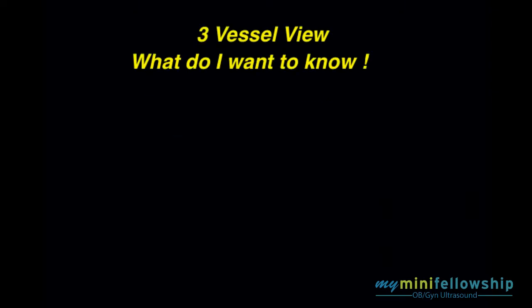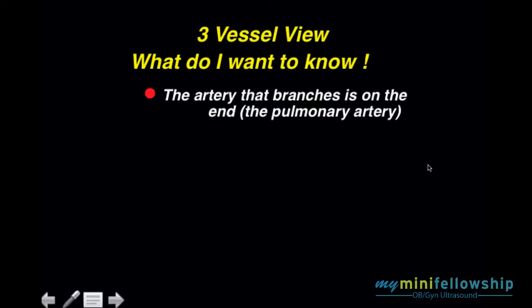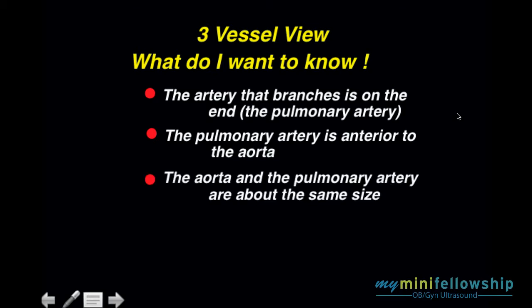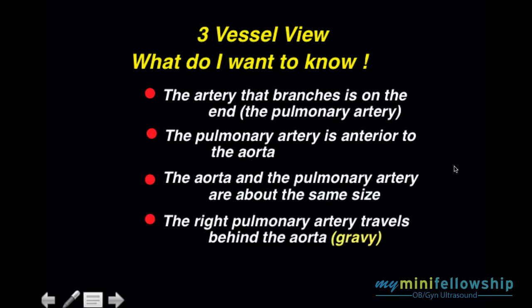What do I want to know about the three-vessel view? I want to see that the artery that branches is on the end — that's the pulmonary artery. I want the pulmonary artery to sit in a more anterior position than the aorta. I want the aorta and pulmonary artery to be about the same size — I'll modify that criterion a little later. Finally, the right pulmonary artery travels behind and touches the aorta, but I don't need to see that specifically; any branch confirms the pulmonary artery.